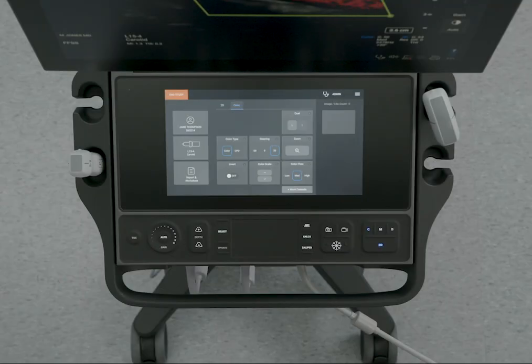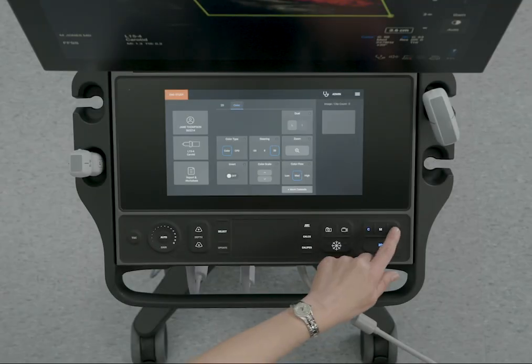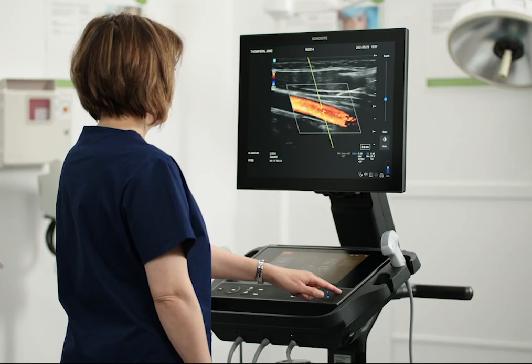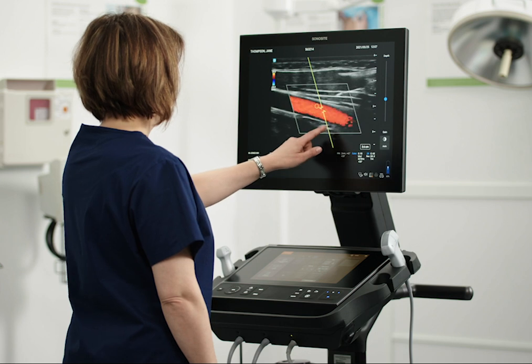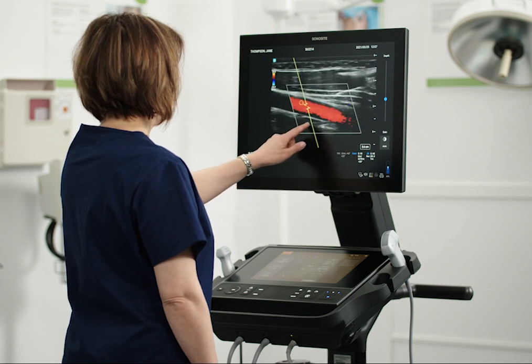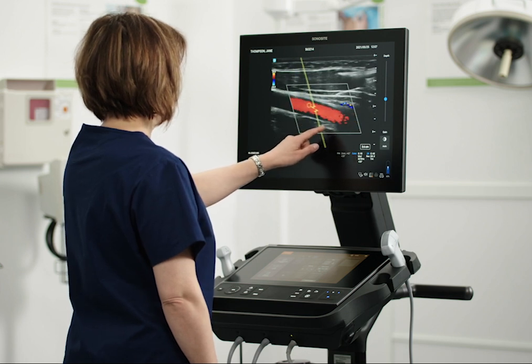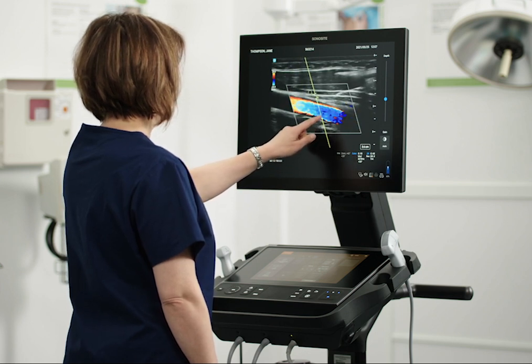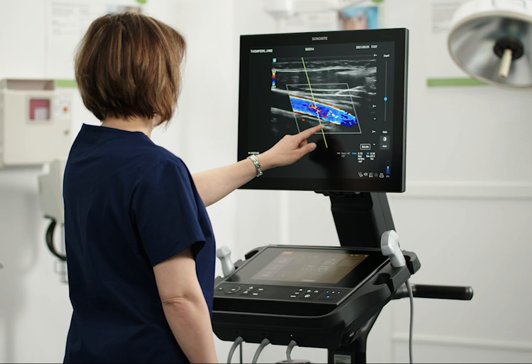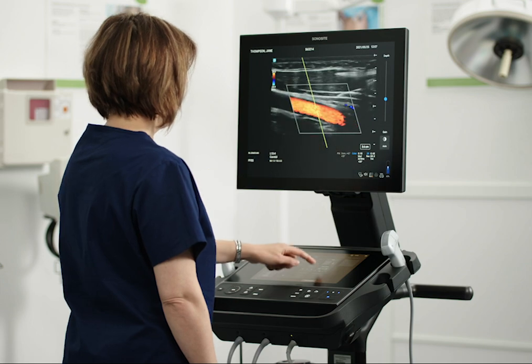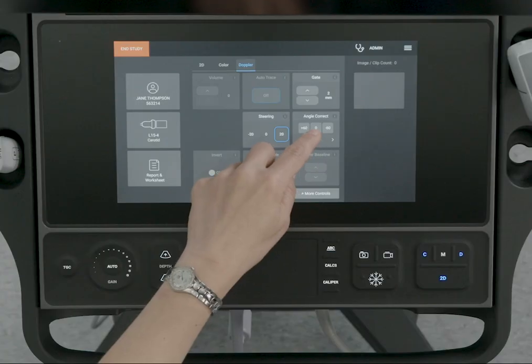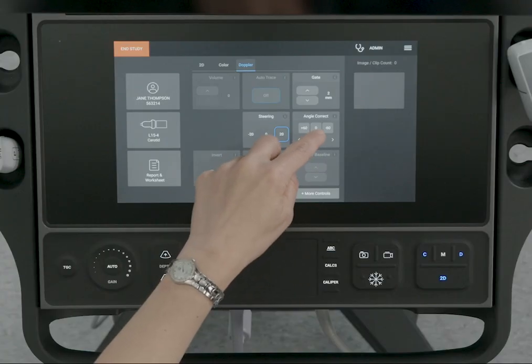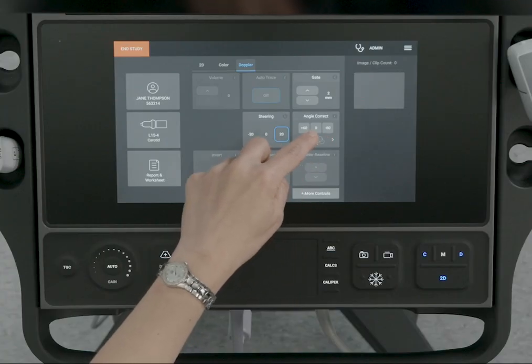Use the touchpad or touchscreen to position the D-line and gate. Horizontal movements position the D-line and vertical movements position the gate. To correct the angle of the gate, use the Angle Correct control on the touch panel.